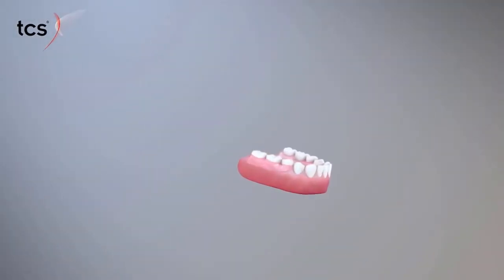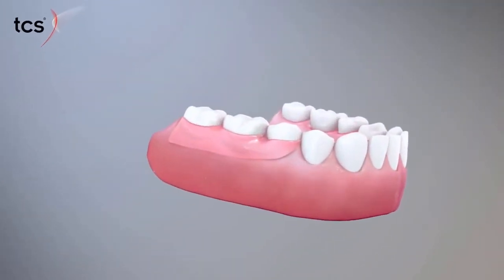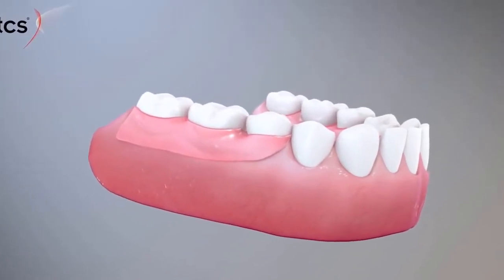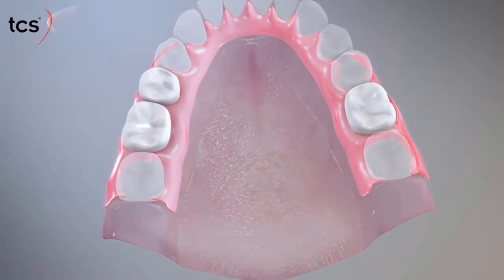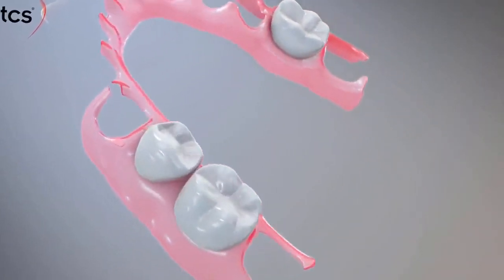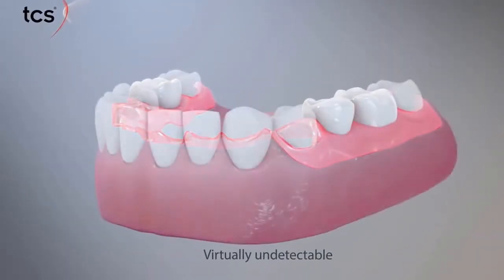The unique properties of the material allow it to engage undercuts in the mouth and use them as retention. The translucent pink shade blends in with natural tissue in the mouth, making them virtually undetectable.